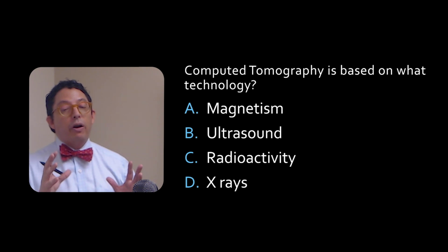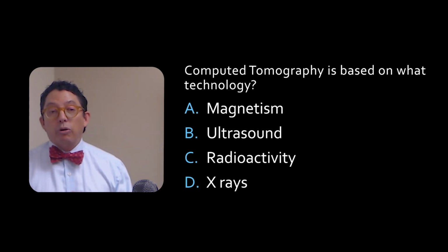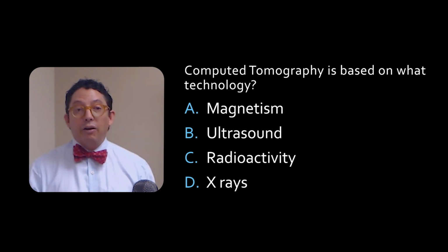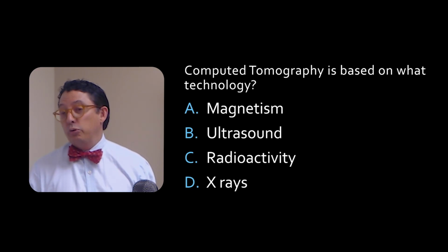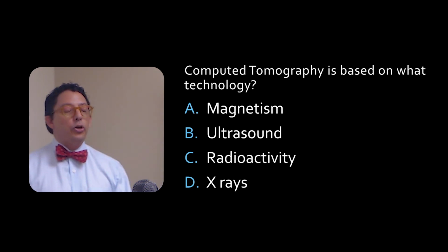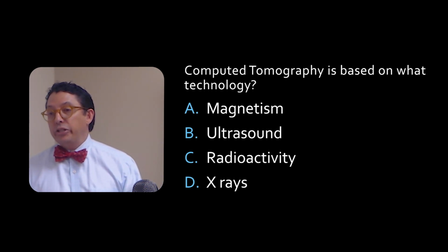And this is going to be very important in your medical practice, because we're going to talk about some of the effects that these photons that are X-rays can have in the human genes and human cells, because they can harm them if you get exposed to too many of them. So it's really important to know which of the technologies that you're utilizing use X-rays. And this is what we call ionizing radiation.